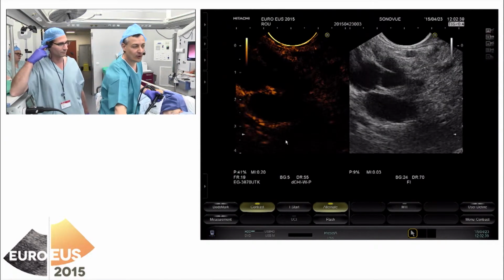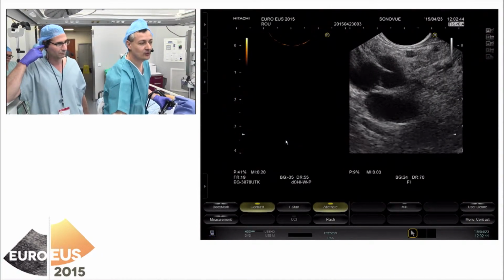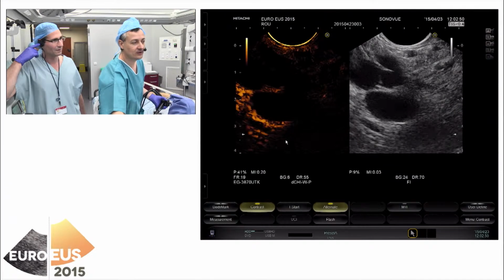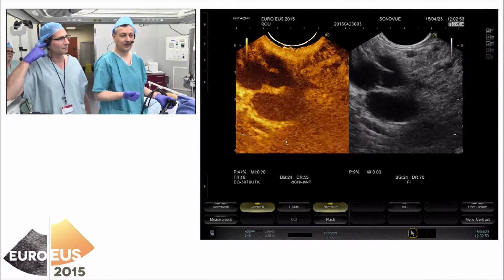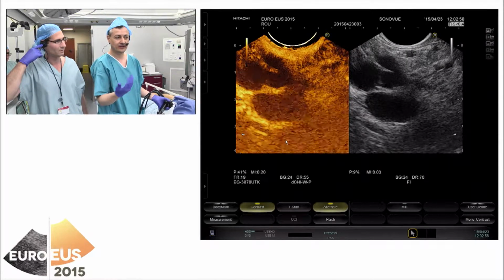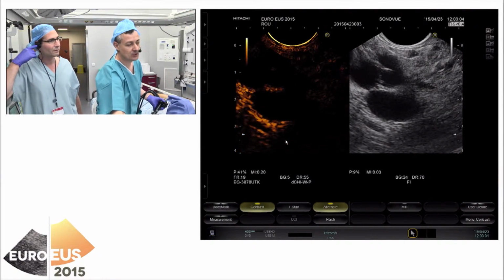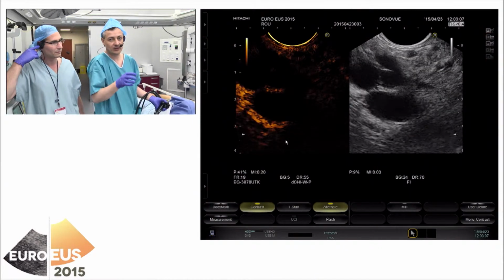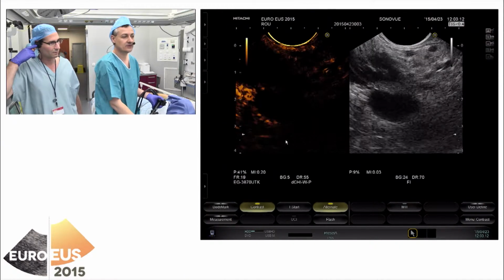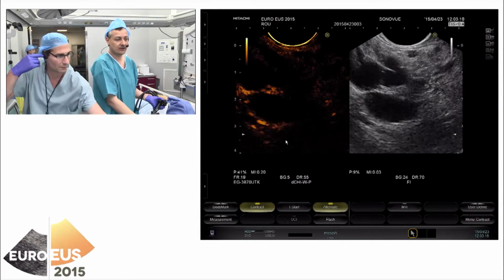So you don't want to decrease the gain too much. You don't want to do it like this because you won't see anything after contrast. But you don't want to keep it like this either, because now you get what Christoph was mentioning. You get signal also from the fundamental, the conventional grayscale. So you have to keep the gain. Let's say we usually work with 5, so somewhere between 0 and 5. You set up the gain and keep it like this for the whole examination. We want to see some signals, but very faint, on the left side of the image.